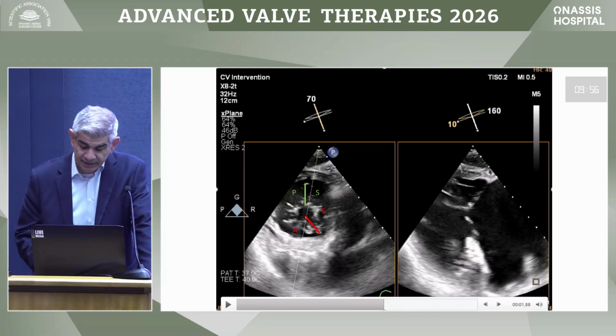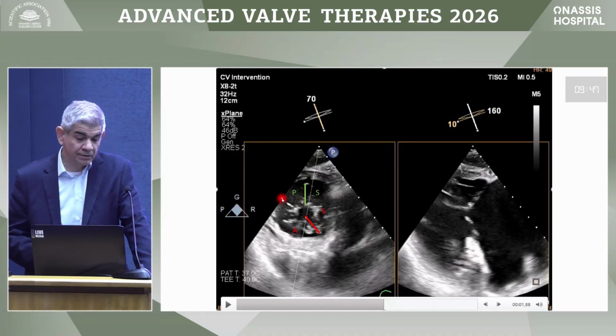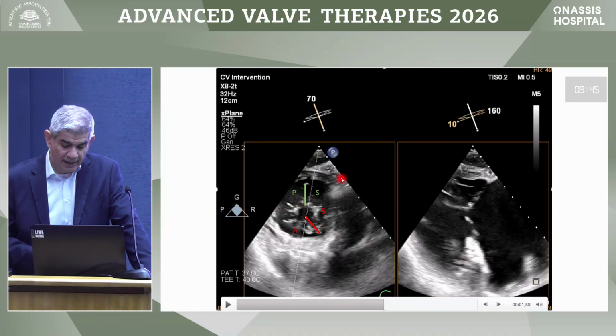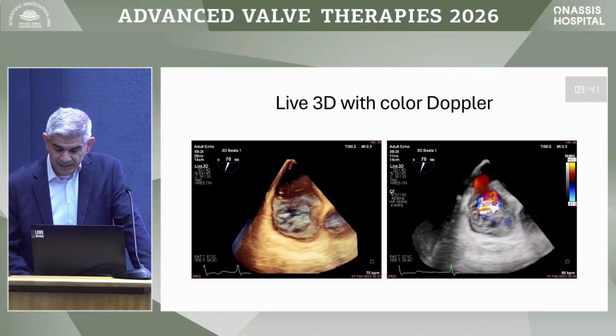You can see the septal-anterior coaptation zone here, which will imply that our device would be in a 2-8 configuration, versus septal-posterior, which would be a 3-9 configuration for our devices. I will skip over these images.